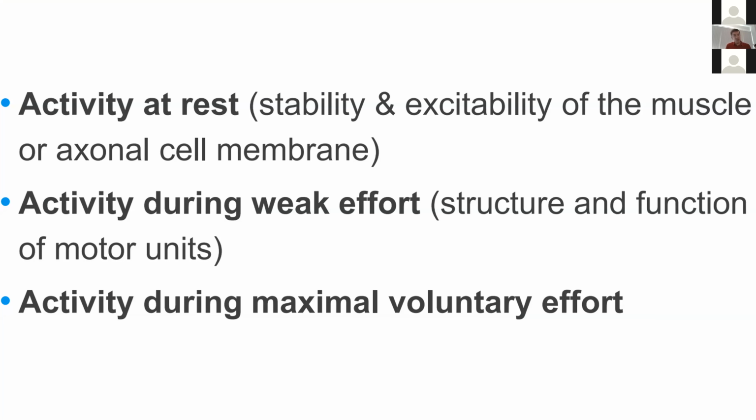Again, after the activity at rest, we go with our needle to look at some activity during weak effort. So we're going to find some more evidence for the recruitment pattern of the muscle fibers of the motor unit.